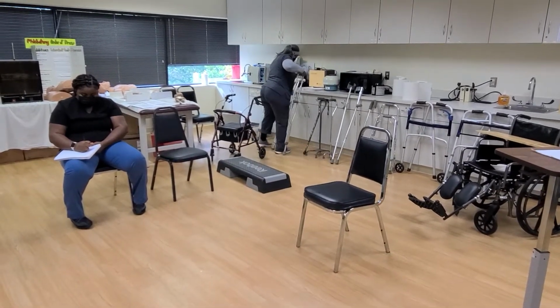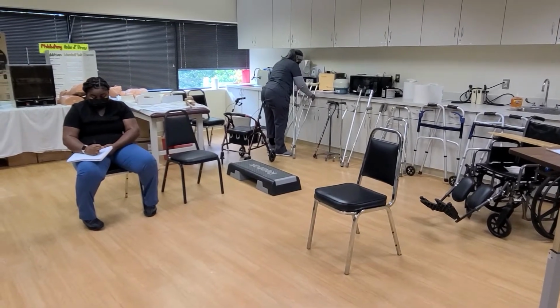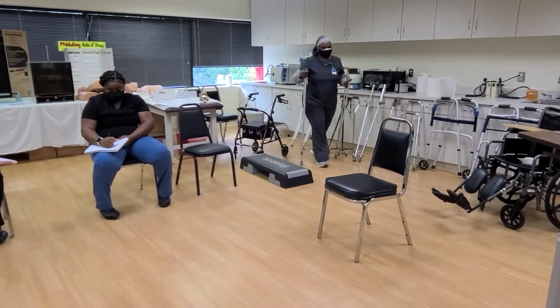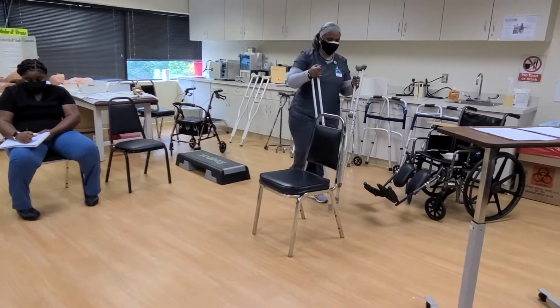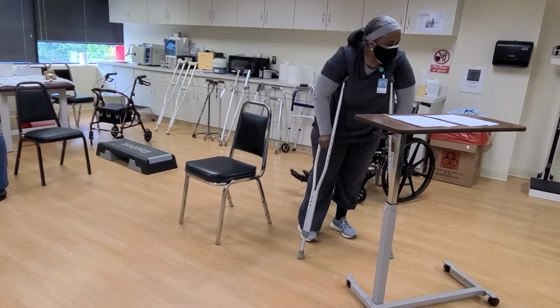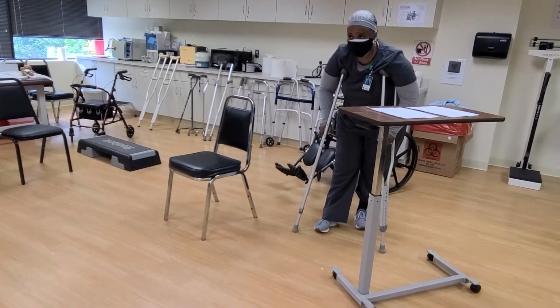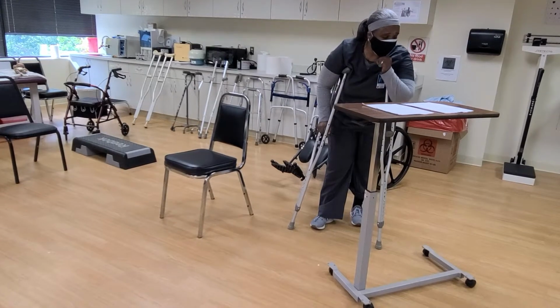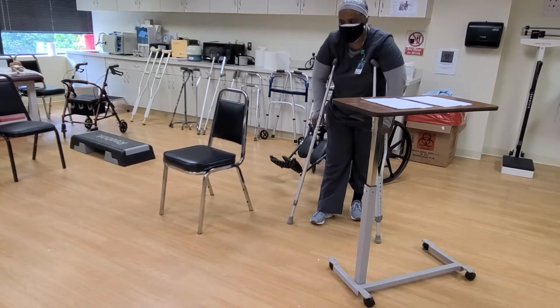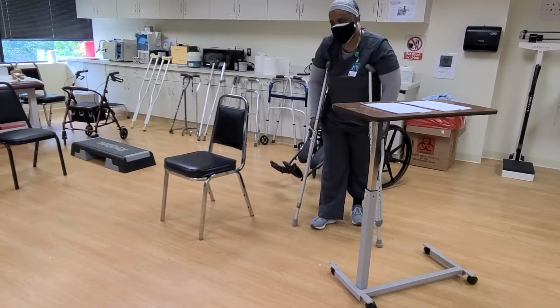Let me put this here. Now, you'll see a lot of people on this, right? Who should be on these crutches? People who have good balance, maybe younger, and those who can really tolerate a lot of weight, okay, on this hand grip.